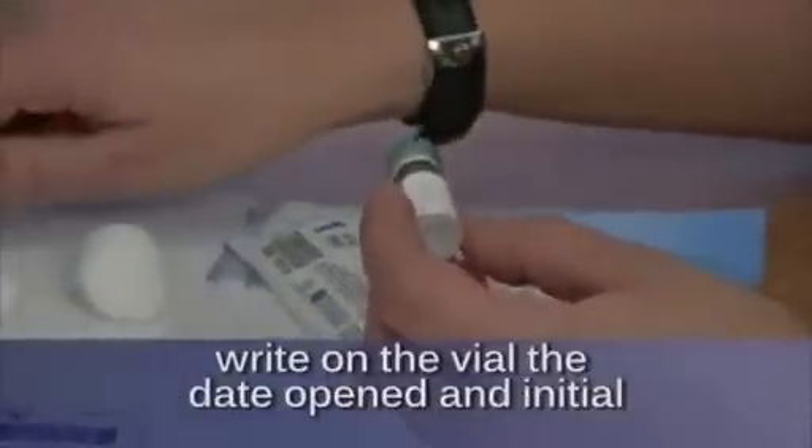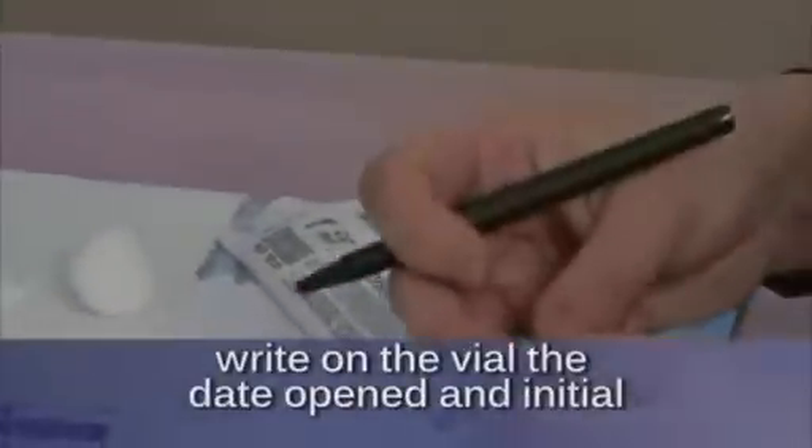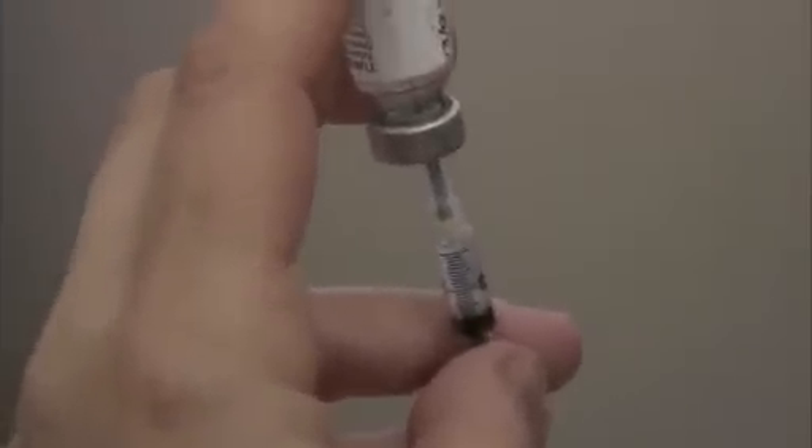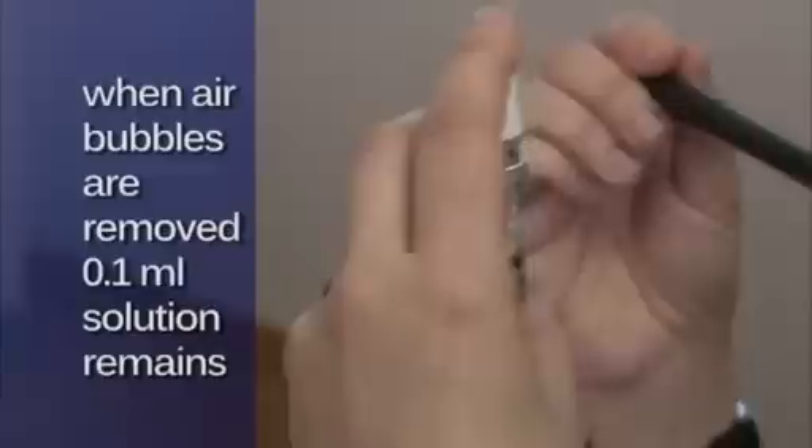Write the date opened and your initials on the vial. Draw out more solution than required to ensure that when air bubbles are removed, 0.1 mL remains.